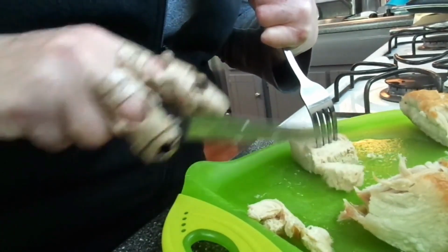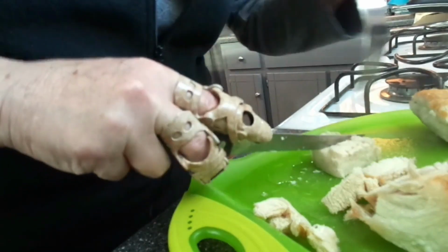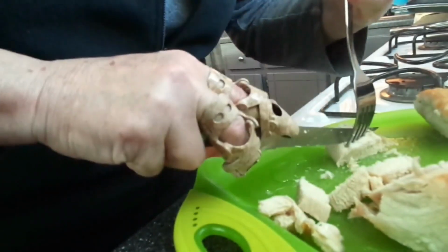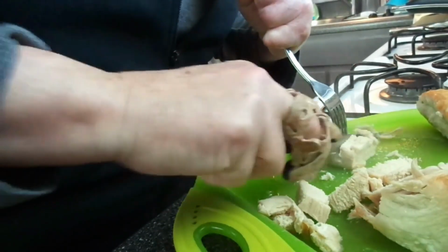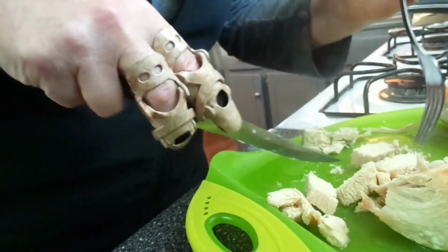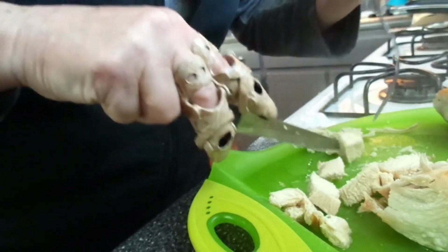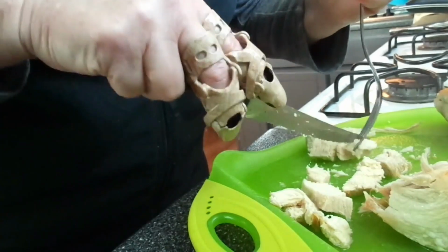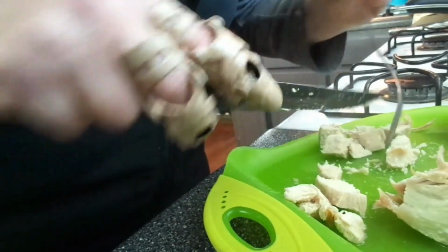So as you can see right away from this video, this patient has numerous devices that they're wearing, and that can be said for just about any partial hand amputee. A lot of times it's not just a PIP driver or an MCP driver. Sometimes it's a combination of the two that they utilize to achieve different grasps or different functions to restore that partial hand amputation.